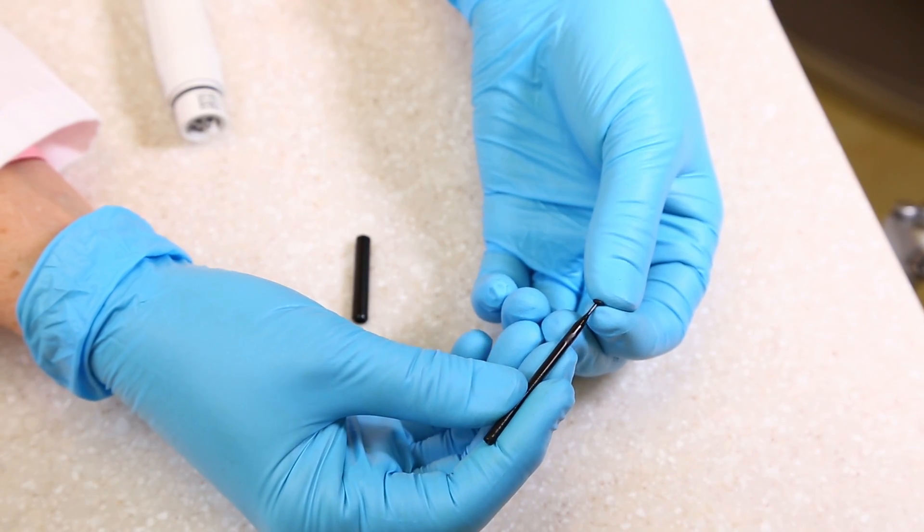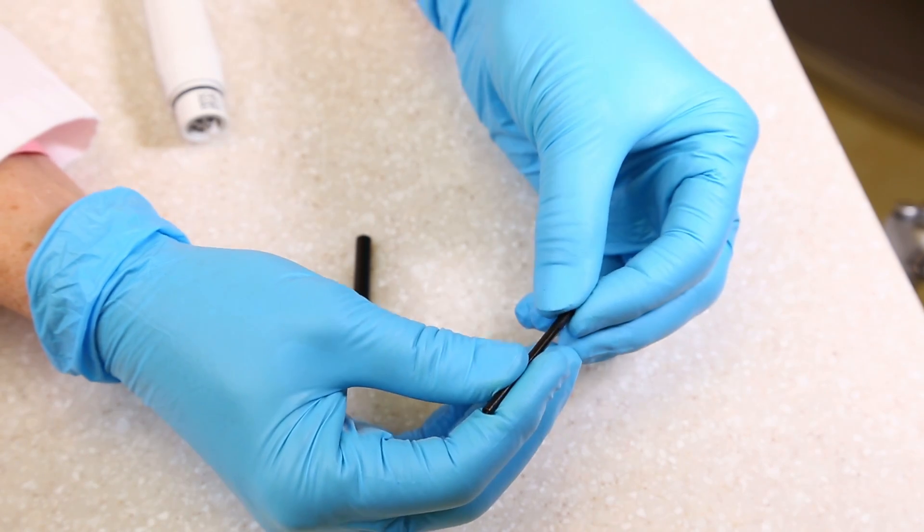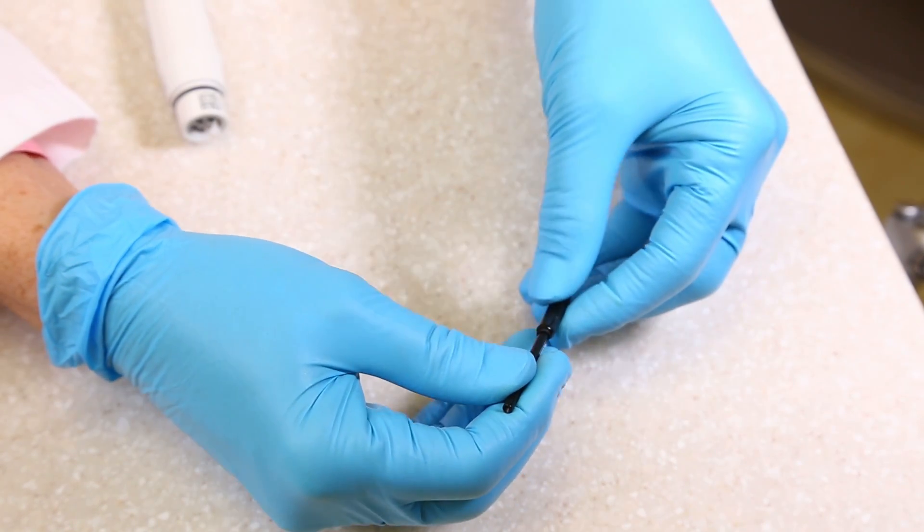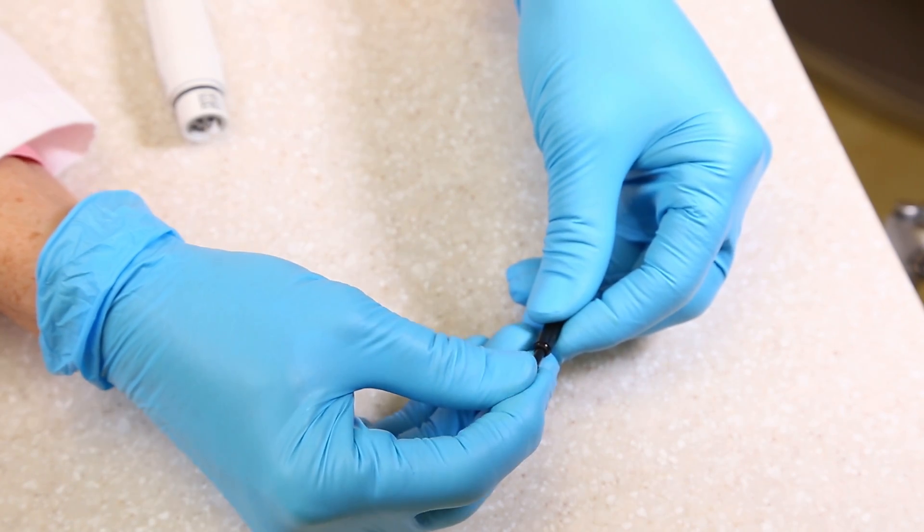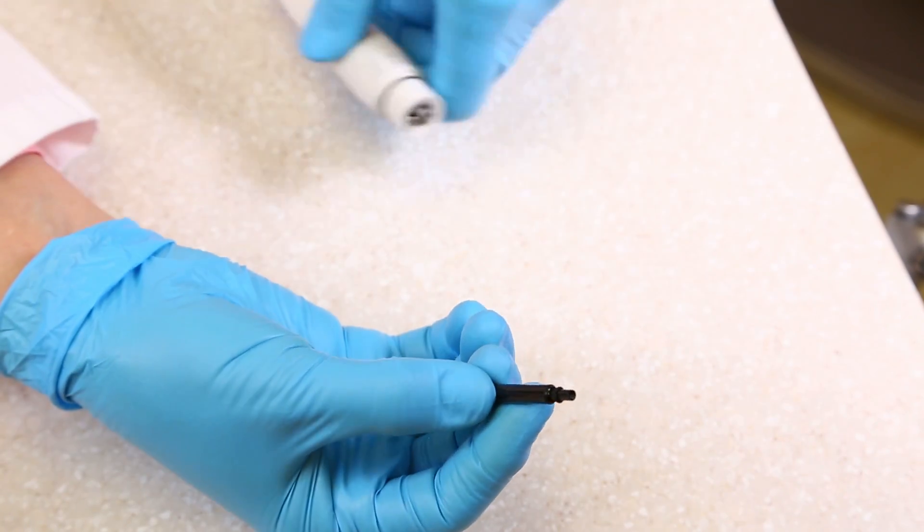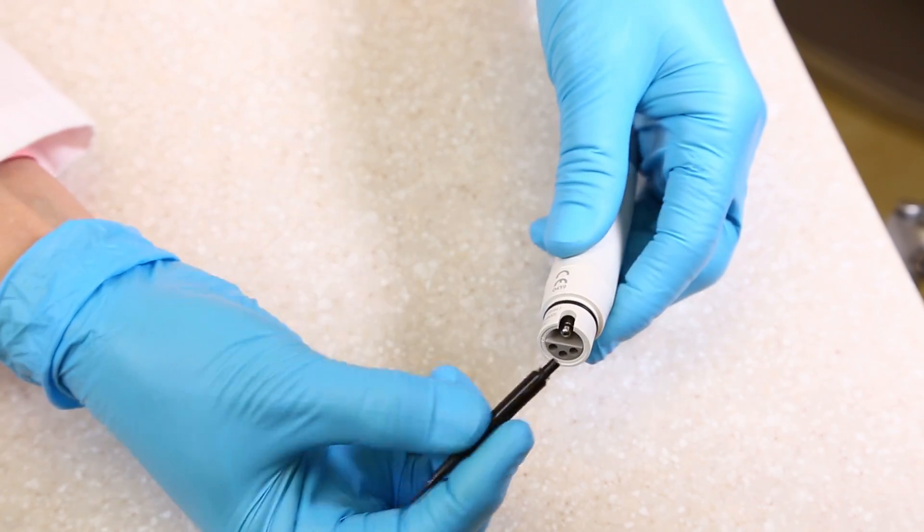Place a new o-ring on the pointed end of the thin plastic rod. Slide the o-ring to within 6 mm of the opposite end. A drop of oil may be helpful in sliding the o-ring. Slide the hollow tube over the thin rod from the pointed end to the o-ring.